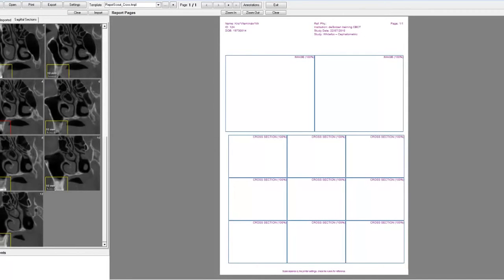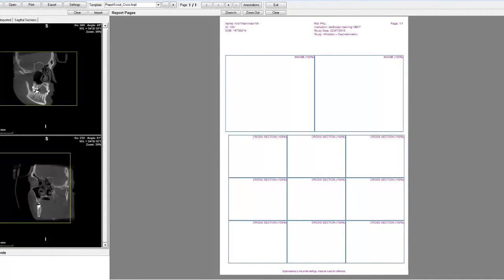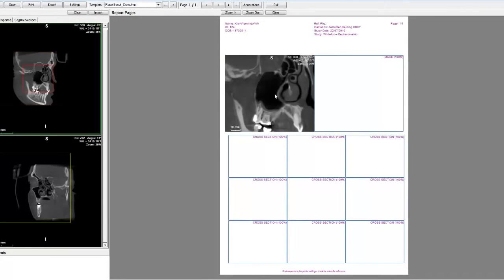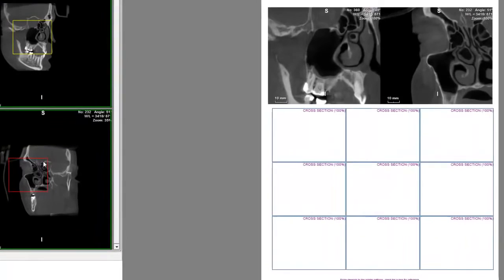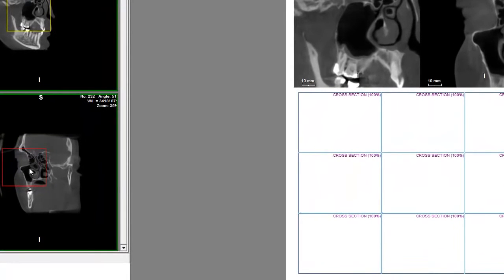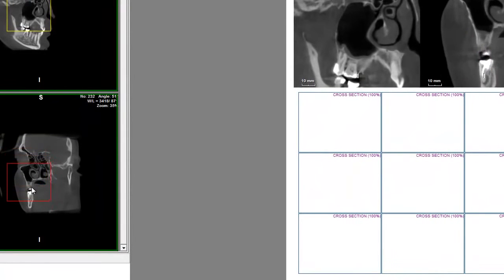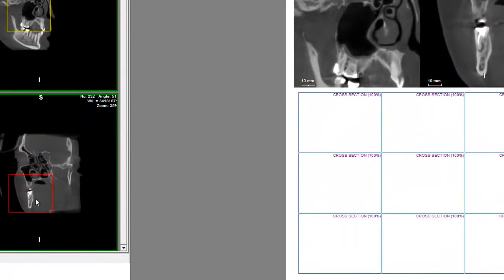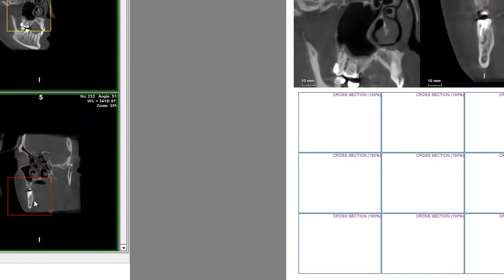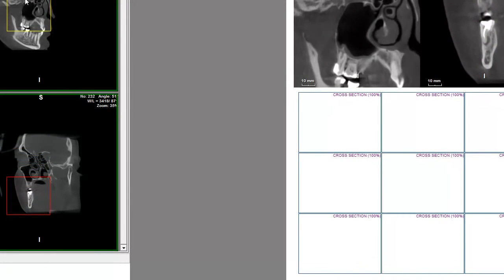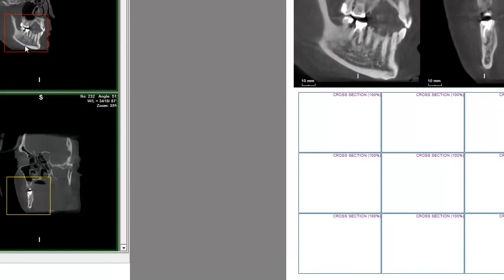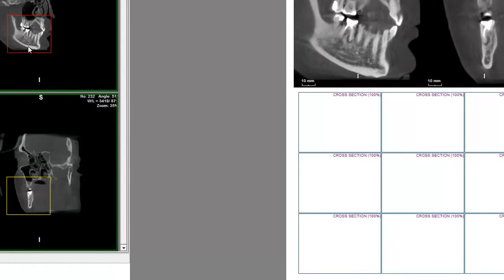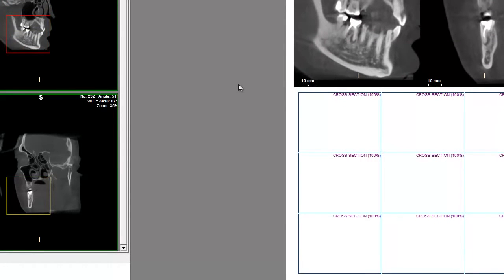Let's do that quickly here. And as you can see, they are not centered. Here you always get the square. But that can be corrected easily. For example, this one here. And this one here. Okay? So I get here a nice image that I need.